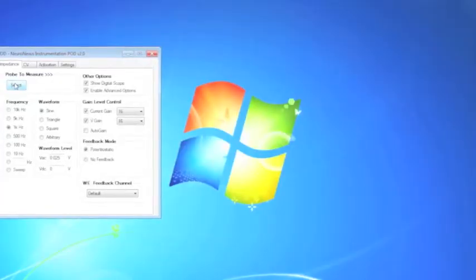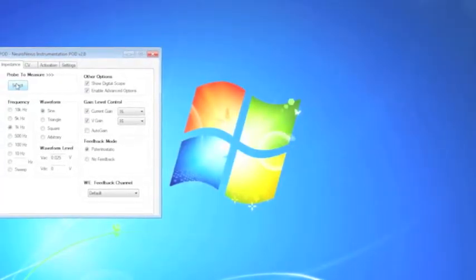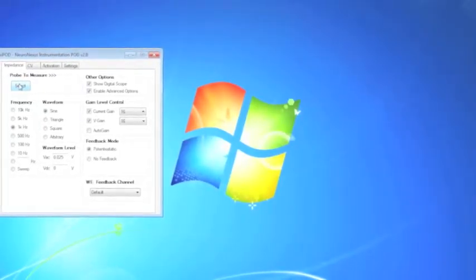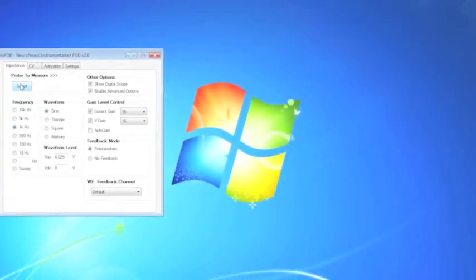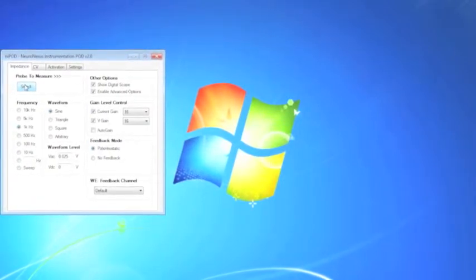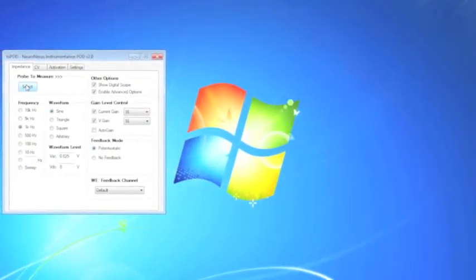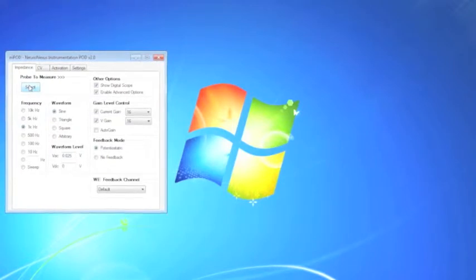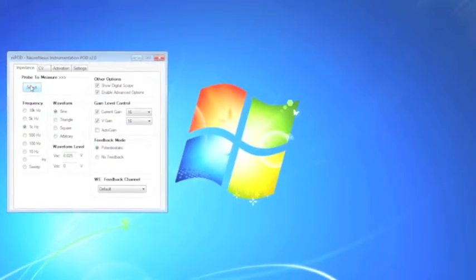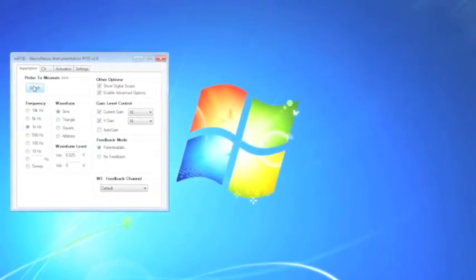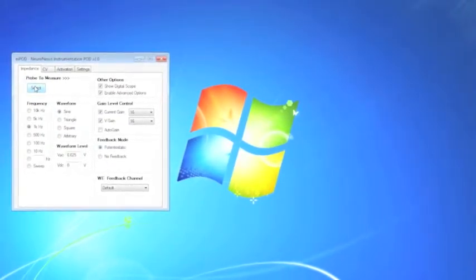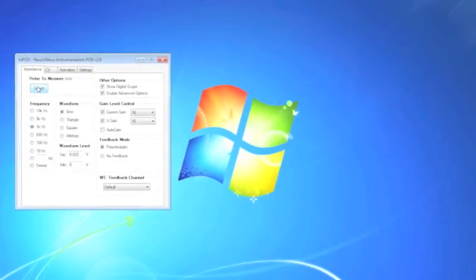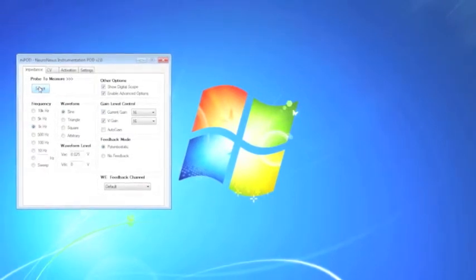From the main interface, you can change frequency, waveform, and gain settings. By default, the measurement is done applying a 1K sine wave. For advanced operations, you can change the waveform settings or run a frequency sweep. For day-to-day measurements, it is not necessary to change the settings here.